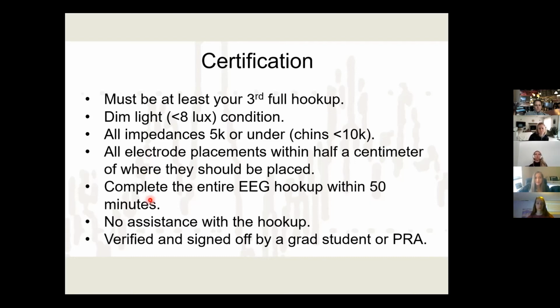And then you actually have to complete the entire hookup in 50 minutes. So usually I say that measurements should take you about 15 to 20 minutes, and then gluing will take you the rest of the time. If it's your first full hookup, it'll probably take you like 2 hours just because you're getting used to everything, and that's okay. But for your certification one, you want to get it done within 50 minutes.